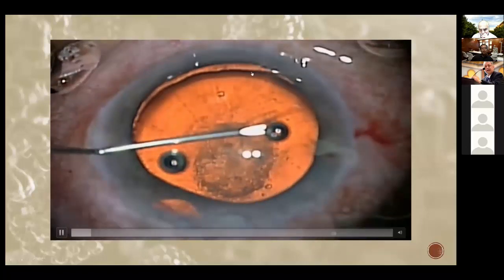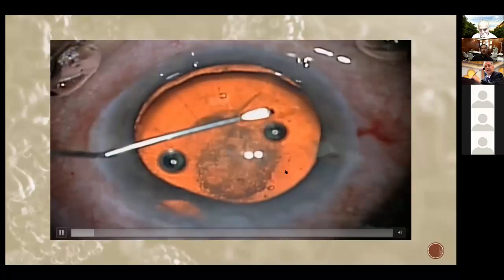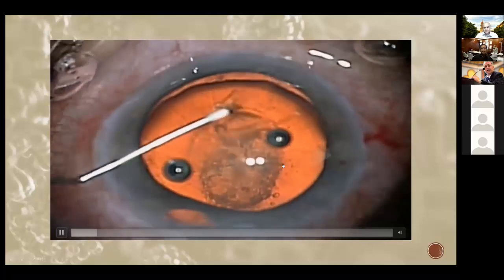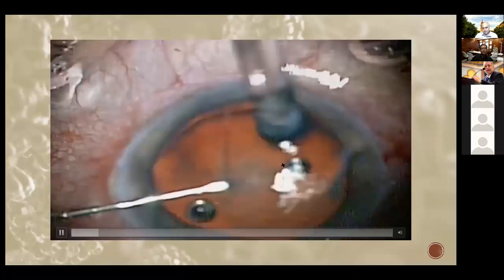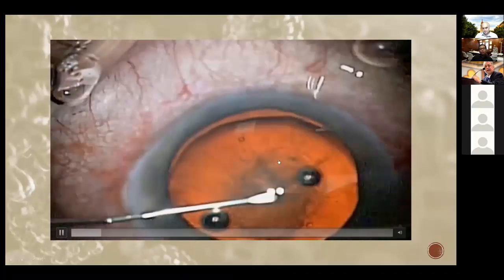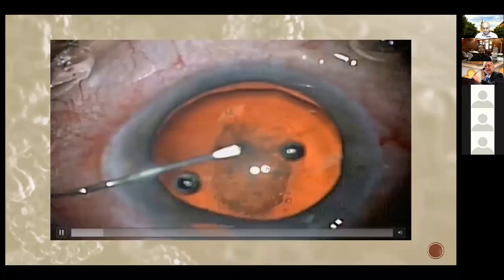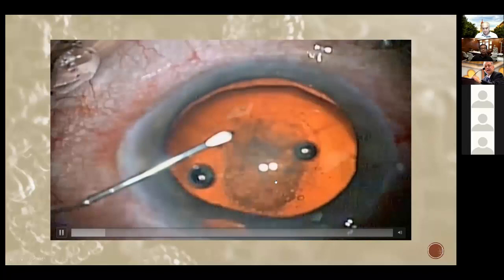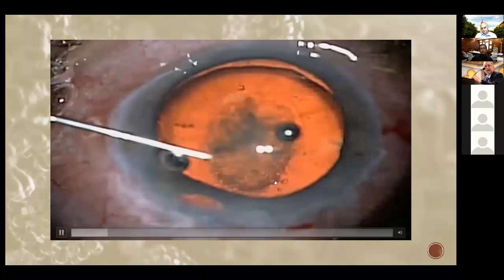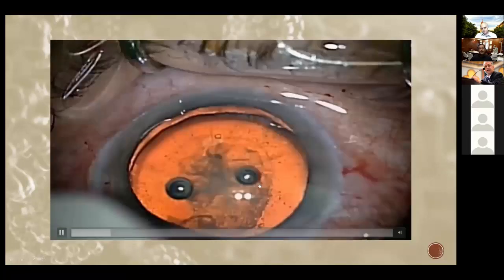As you can see, we have almost 140 to 160 degrees of zonular dialysis or dehiscence. The rhexis is finished smoothly and nicely. And now I'm faced with the choice. Do I take a chance and do my phaco and lose more zonules and then lose the ability to put a CTR, or should I put it in the beginning? And I decided to put my CTR at the very beginning.